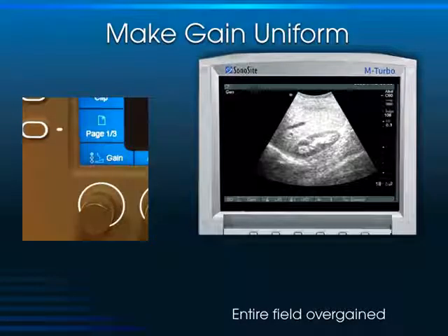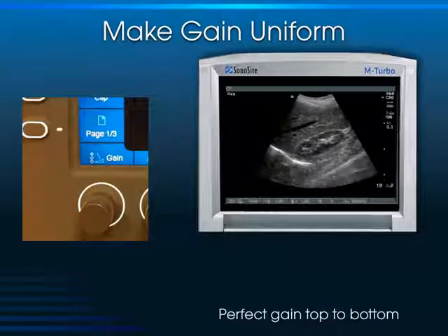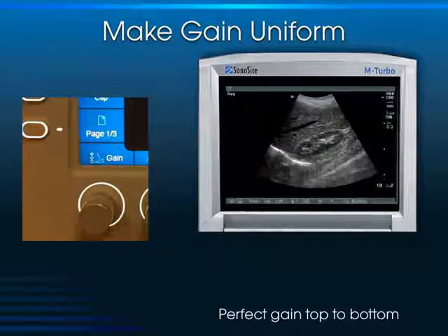How do we adjust the gain? On the Sonosite S device, there's a rotary knob. You turn it counterclockwise, and we take this severely over-gained image down to a nice level of gain where I can easily see that the cortex of this kidney is less echogenic than the liver parenchyma.